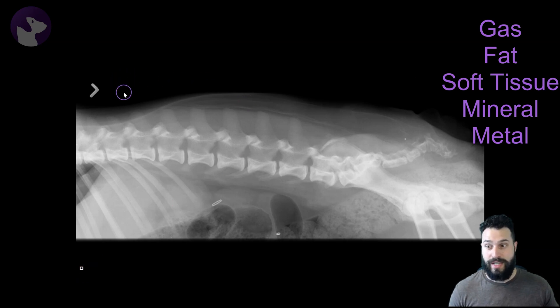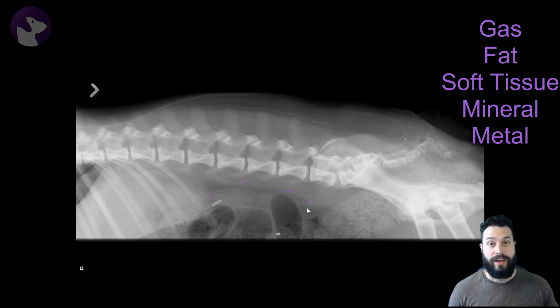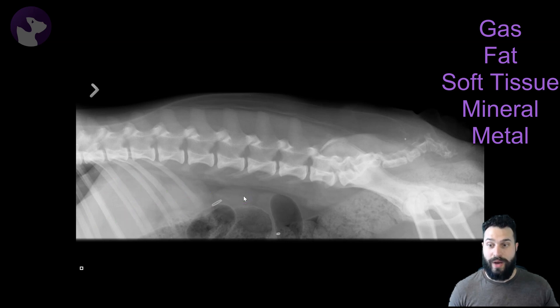We have gas present outside the patient or in the lung. We have fat present in the subcutaneous tissues or in the retroperitoneal space. We have soft tissue present at the level of the liver, the stomach, and the kidneys. We then also have bone present — all of the vertebrae and the pelvis.